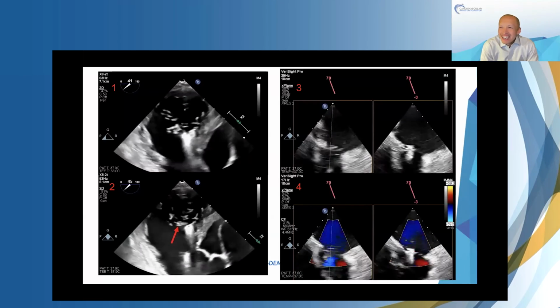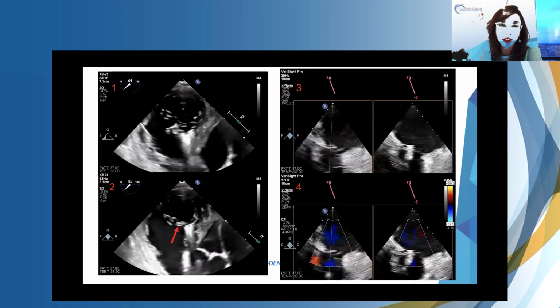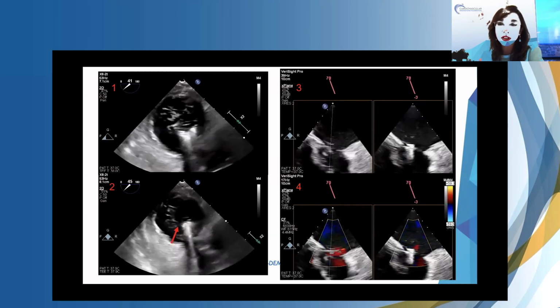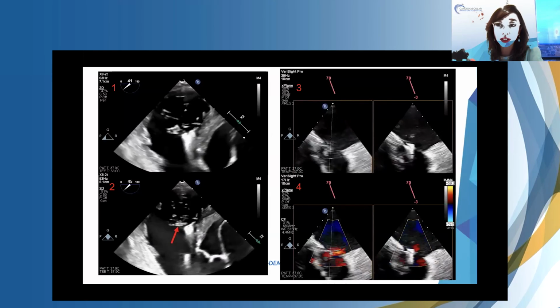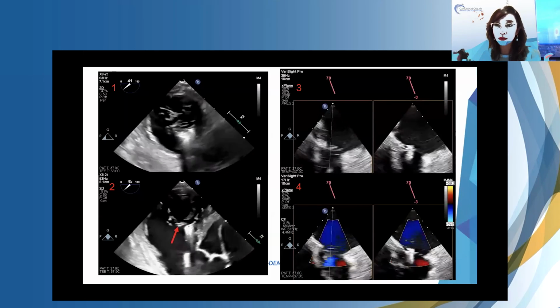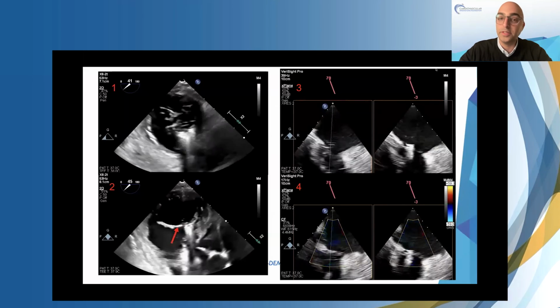So the arrow on clip 2 here. Oh, who was saying something? Sorry, Edris, but I really like the comment by Gagan about going up and down between mid-esophageal and transgastric. That's where, I hate to say this, but really your esophageal injuries come from. So what we do, really improving the workflow, is you park your TEE in your transgastric view, and then you can switch to ICE. So you have less manipulation on the esophagus. That's what I found really, really helpful when you have your ICE catheter there. I just park my TEE probe in the transgastric and then flip back and forth with your 3D ICE. Yeah, absolutely. The less probe manipulation, the less risk of GI bleed, which is one of the main things that we worry about as imagers with tricuspid cases.